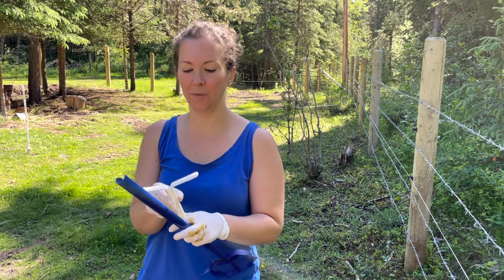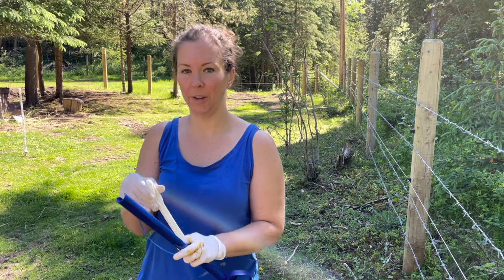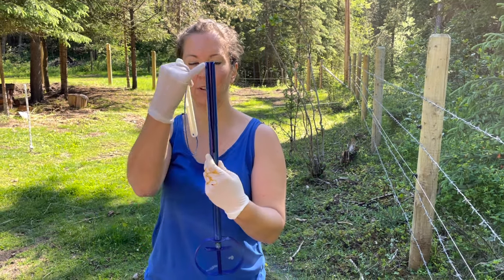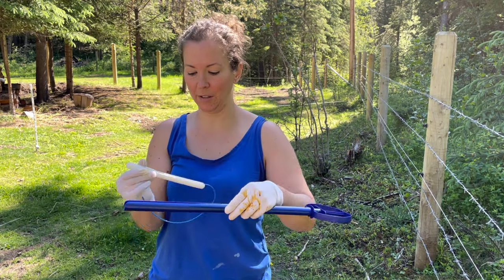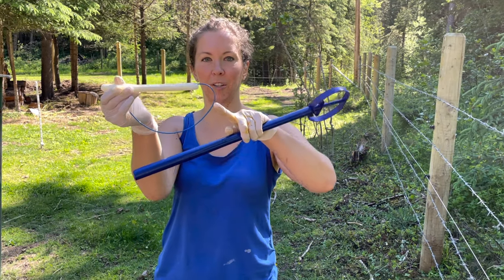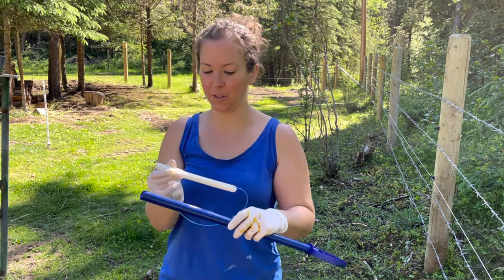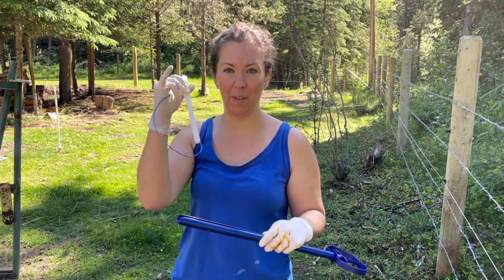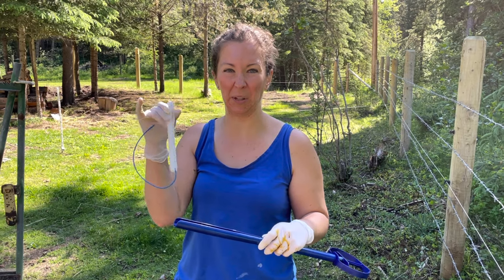So this is our CIDR device. We're gonna fold the wings up straight. This is our applicator — you want this groove facing up as well, and this tail we want to curl down, because the girls, if they have it sticking out and up, they'll bite at it and nibble at it.